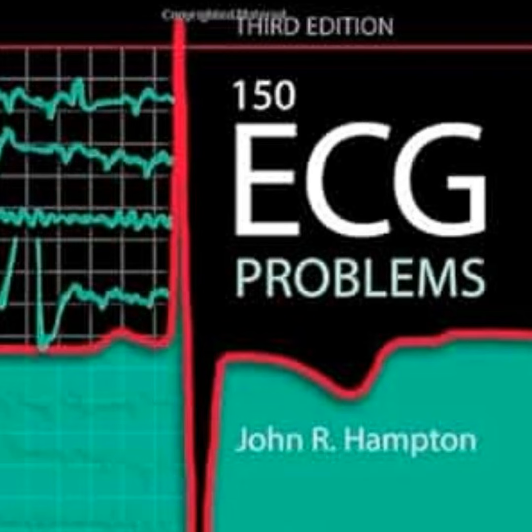The ECG is measuring electrical gradients across cell membranes. So when a coronary artery occludes, the myocardium distal to that blockage becomes hypoxic. It's starving for oxygen. Right. But it takes time for that lack of oxygen to actually deplete the cellular ATP stores. Yeah. And until those energy stores are fully depleted, the sodium-potassium pumps on the cells just keep working. And so the resting membrane potential remains relatively stable. Wow. Okay. So the electrical signature literally hasn't changed yet because the cellular machinery hasn't completely failed, even though the tissue itself is screaming for oxygen.